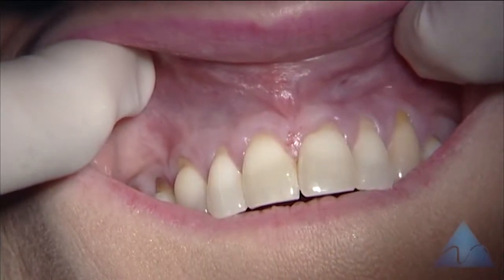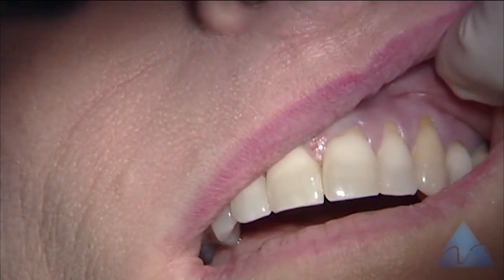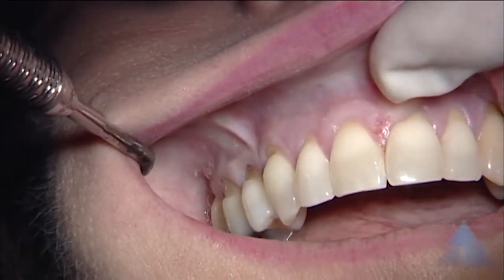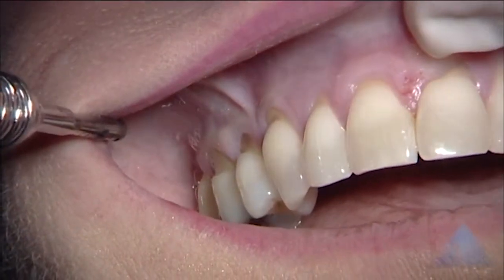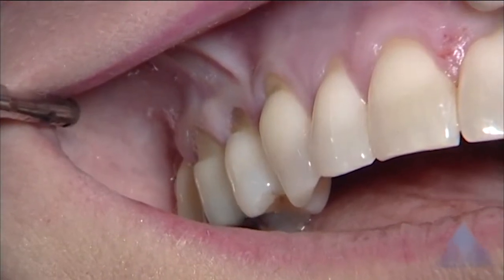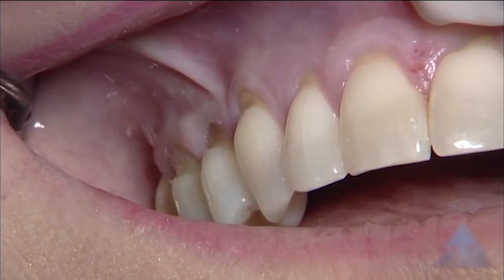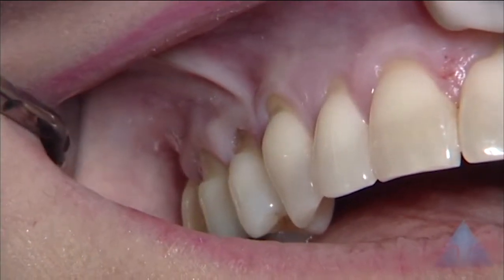Cervical notching on the right canine, and cervical notching and recession involving the canine, first premolar, and molar.